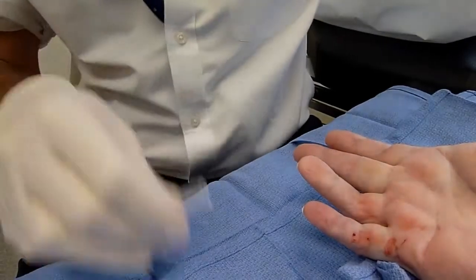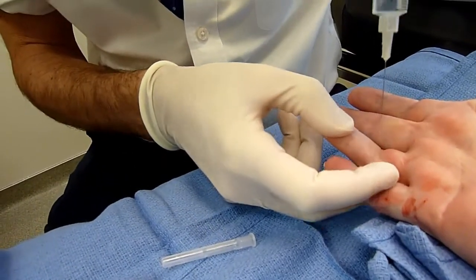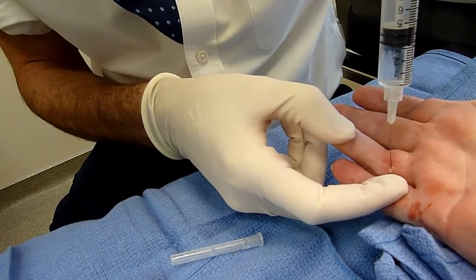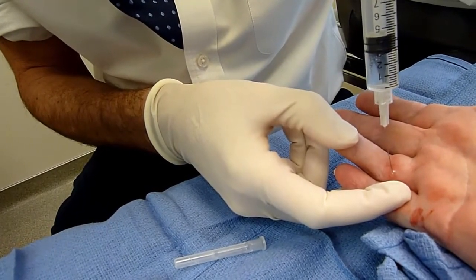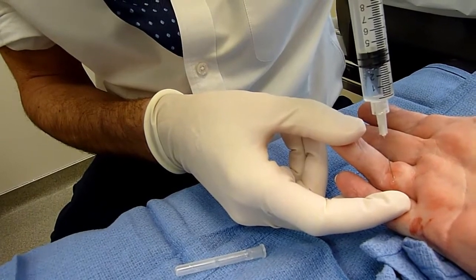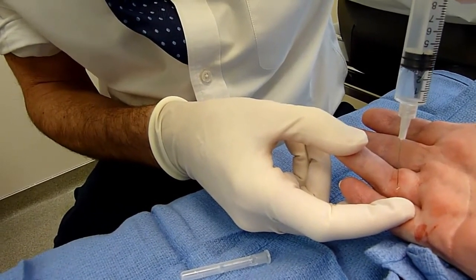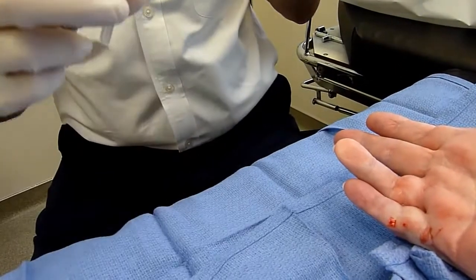Okay. Hold on one second, though. I'm doing the ring finger. Okay, so the cord I can palpate is right there. Okay. Ouch. Barely. Seriously, you're the best at this so far. Yeah, I'll tell you, people with this needle stick say otherwise. They say that was really bad. No. Nope. All right, done there.